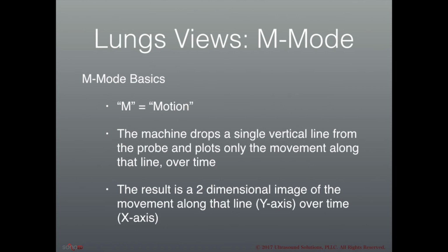Let's talk more about M mode, which is another technique to assess for pneumothorax. Remember that in M mode, M stands for motion, and the machine is going to drop a single vertical line from the probe and then plot motion along this line over time.